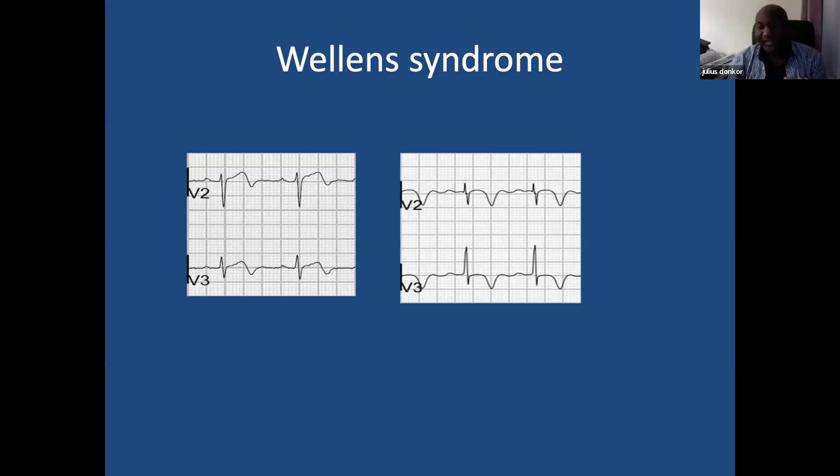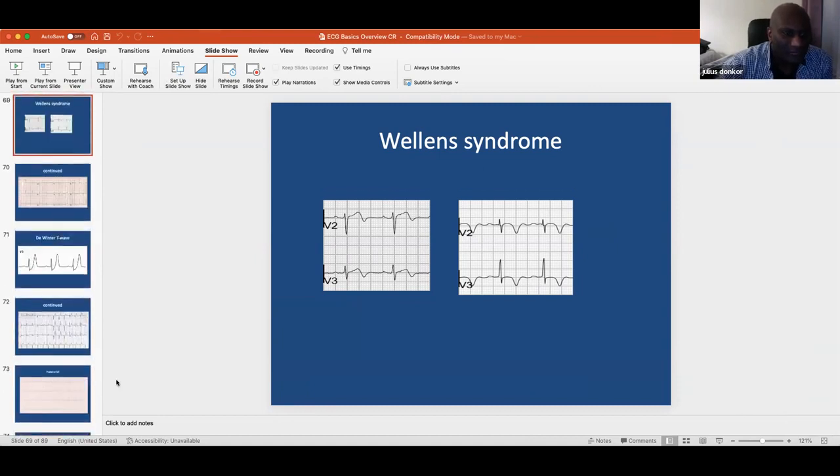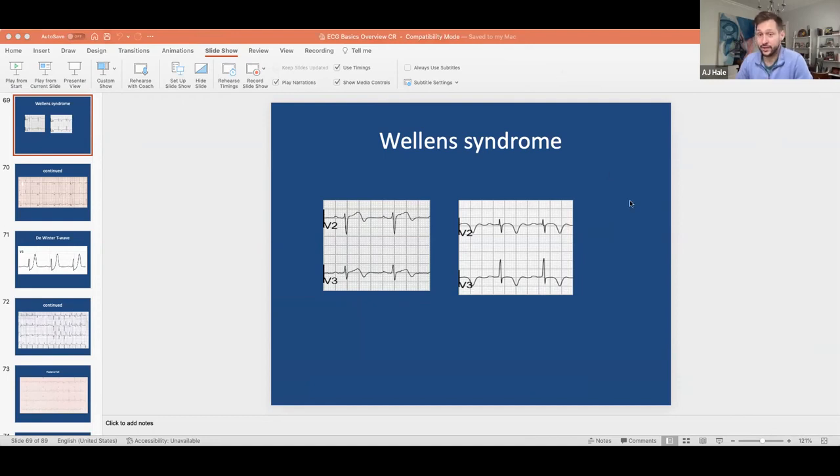All of these differential diagnoses involve an ST elevation component. I can do a differential diagnosis on benign early repolarization, which they used to think was benign. Let me see if I could go into Life in the Fast Lane. Honestly, you can present that to a lot of American doctors, because racial background makes a difference. A lot of the data and studies are based upon white males, and then you try to apply that to other groups and it's dangerous because it's not the same.